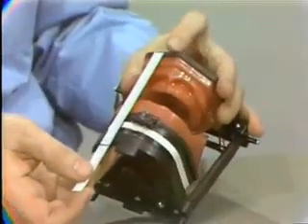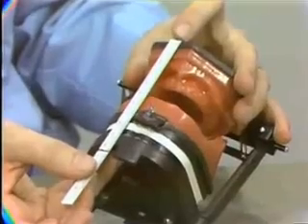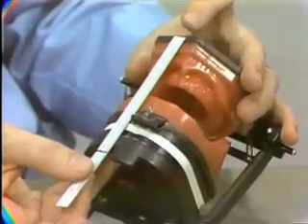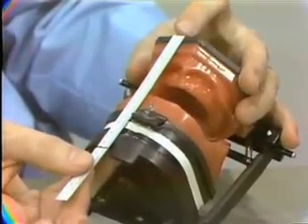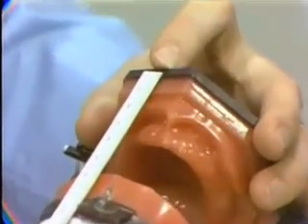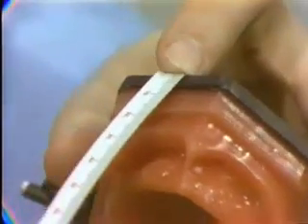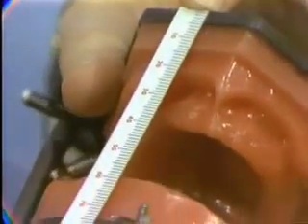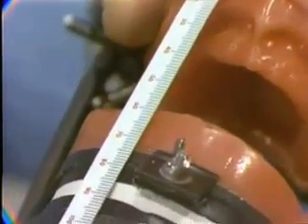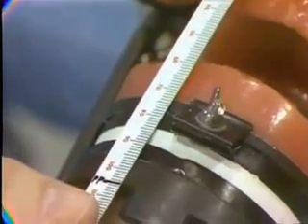So once again, now I have cut the top of the measuring device off at 0. That makes it easy, just by placing my finger at the top, making it flush with the finger to register the 0. And then as I close the patient together, I go through postural position at the bottom, the mark that I've made, PP. You don't need to mark your measuring device for that.